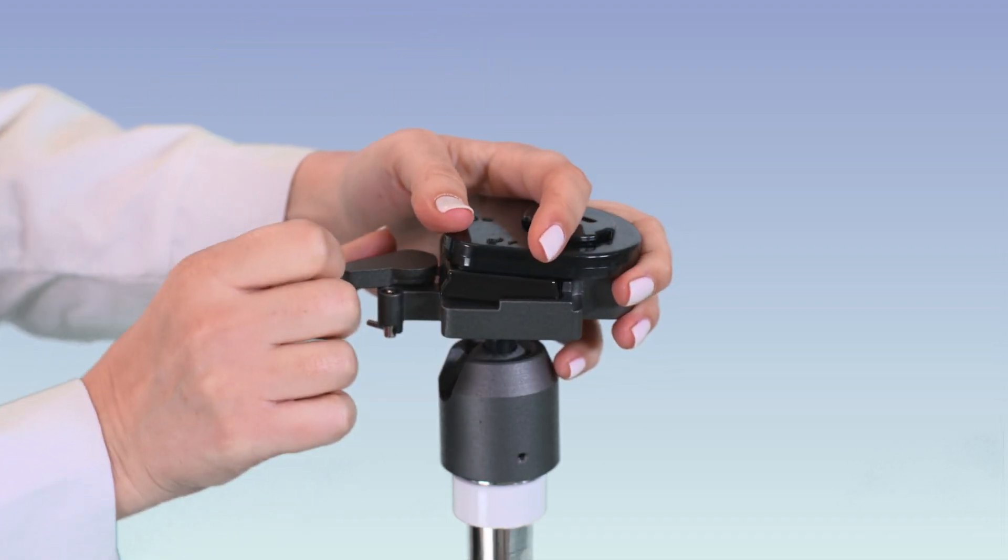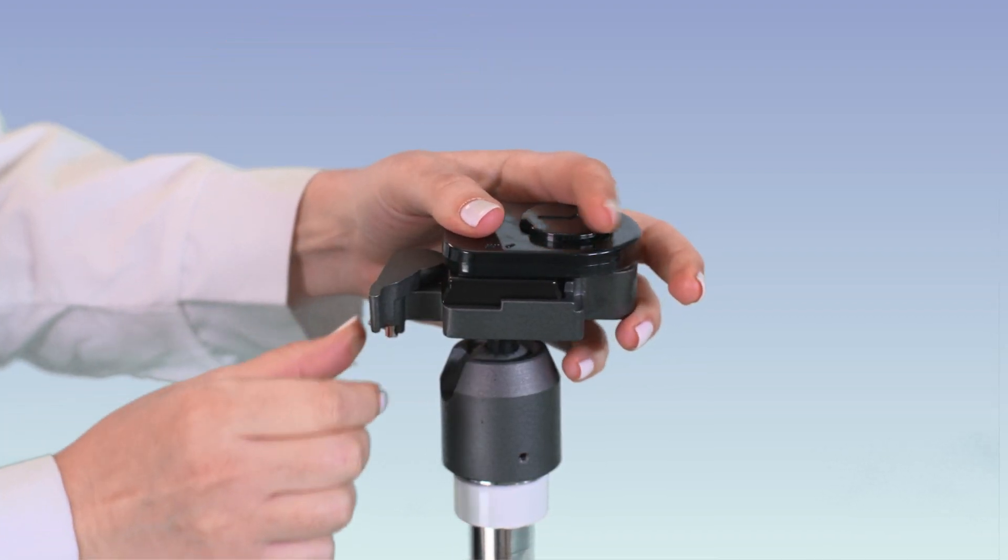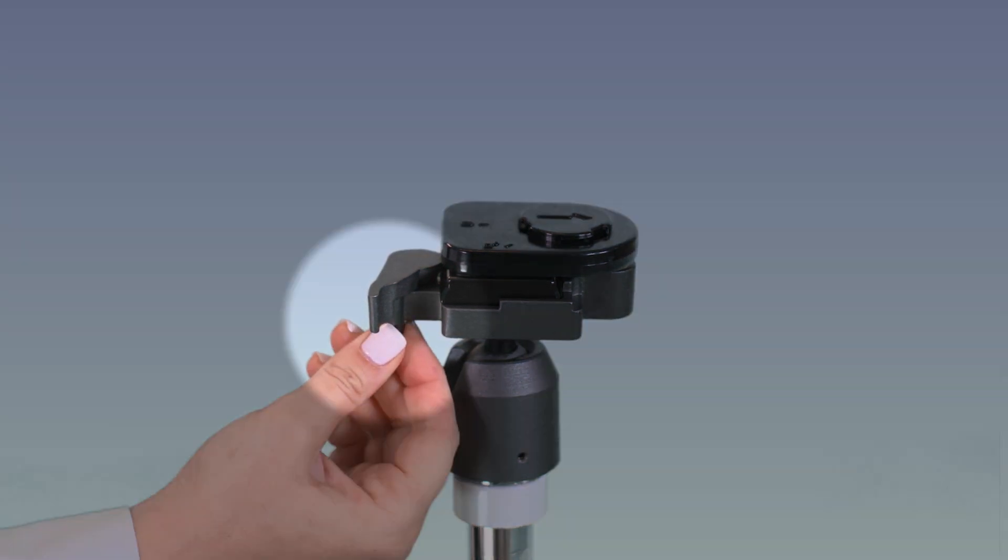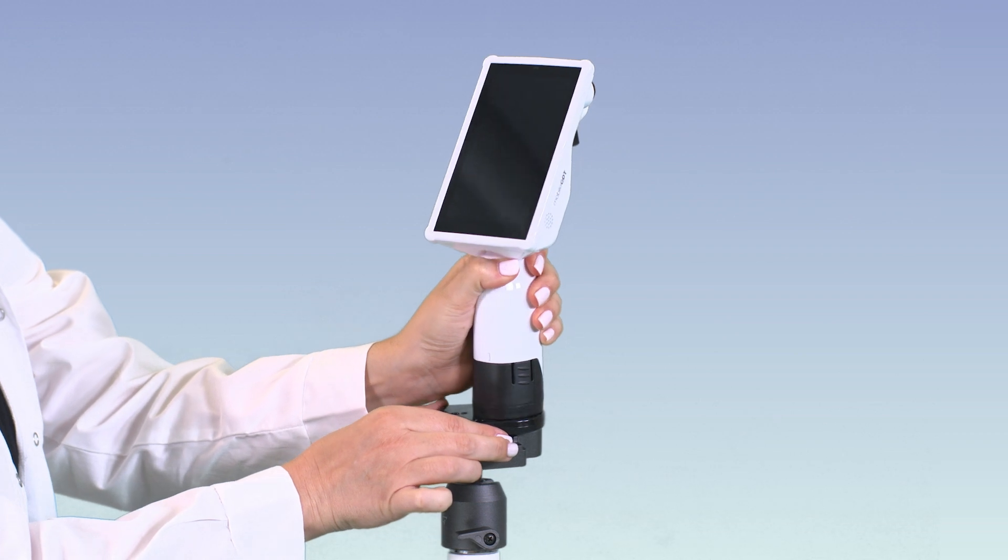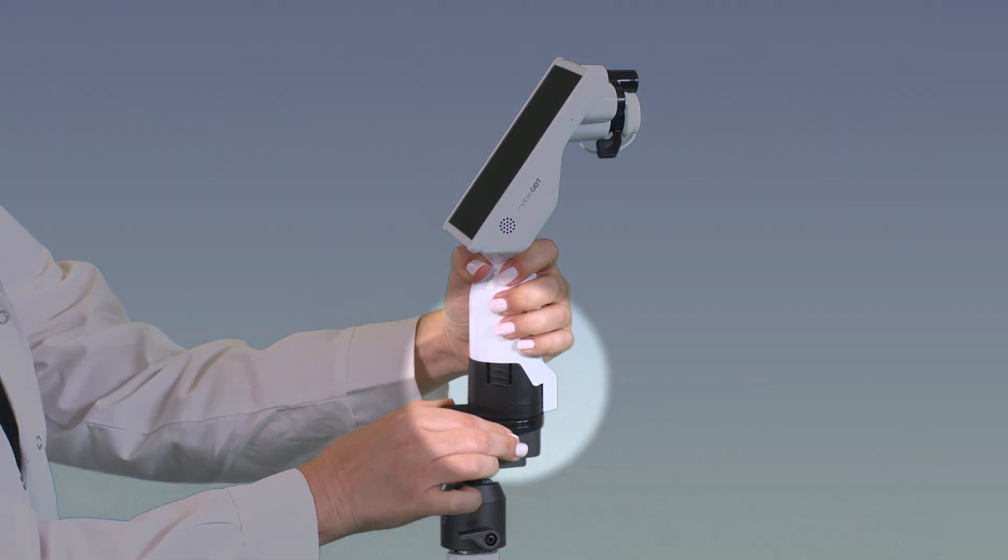Connect the plate to the stand and lock it. Now you can connect the EVA-PRO to the adapter, using a turn movement until it's stable.